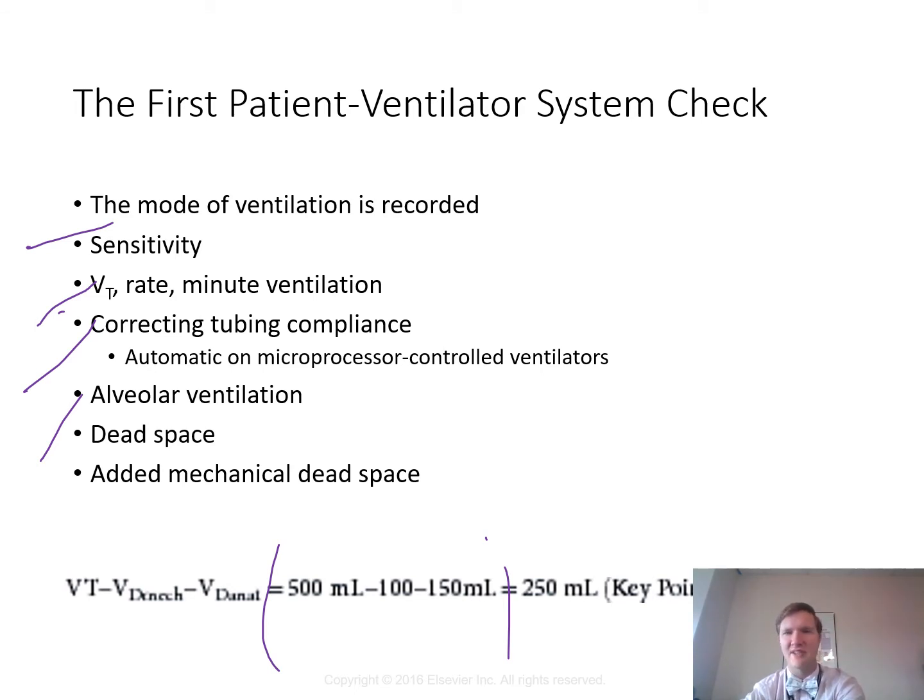So this is a patient that's on volume controlled intermittent. And then the rate must be calculated separately from the patient. So we take that times the rate to look at alveolar ventilation. So that's what we're looking at here. And there's some examples in your reading material as well.